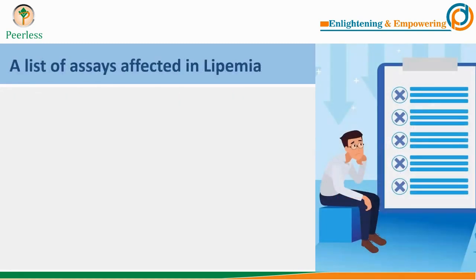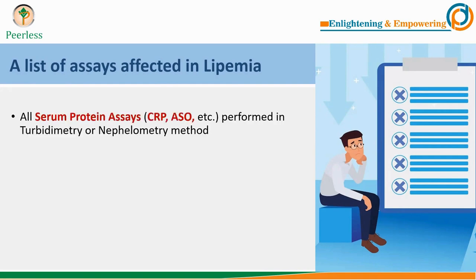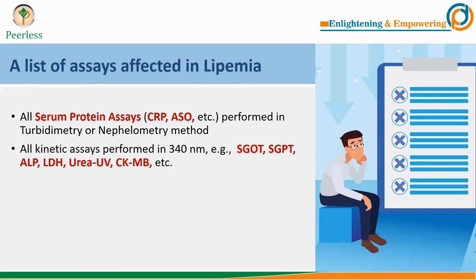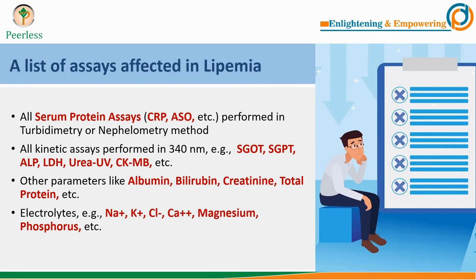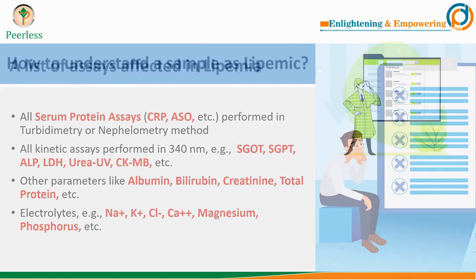As a summary, all serum protein assays such as RA, ASO, and CRP performed by turbidimetry and nephelometry, and all kinetic assays at 340 nanometers — such as SGOT, SGPT, ALP, LDH, urea, CKMB — are affected. Other parameters like albumin, bilirubin, creatinine, and total protein are also affected. Electrolytes including sodium, potassium, chloride, calcium, magnesium, and phosphorus are affected by the use of lipemic samples.